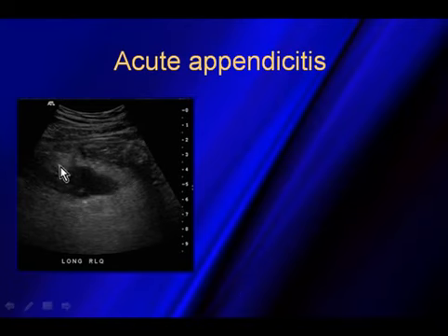So when I started scanning this patient with a high-frequency linear array, I noticed that I just saw this fuzziness deep in the image, and then, as I mentioned earlier, what I like to do is switch to a lower frequency transducer, actually a curved array, because you get a wider field of view. You can see there's just this big fluid collection and a lot of edema going on.